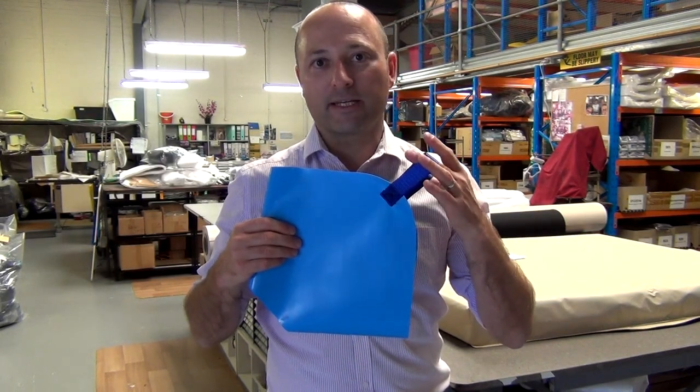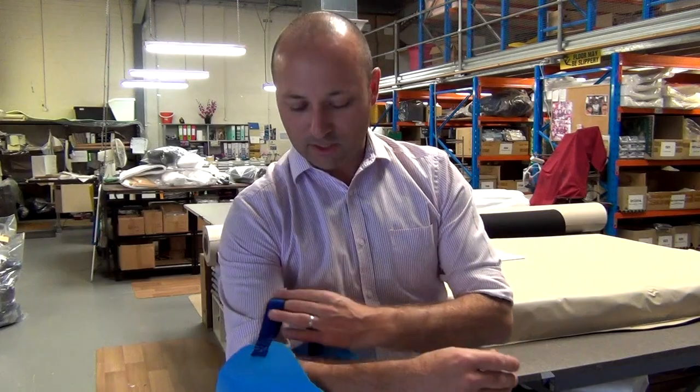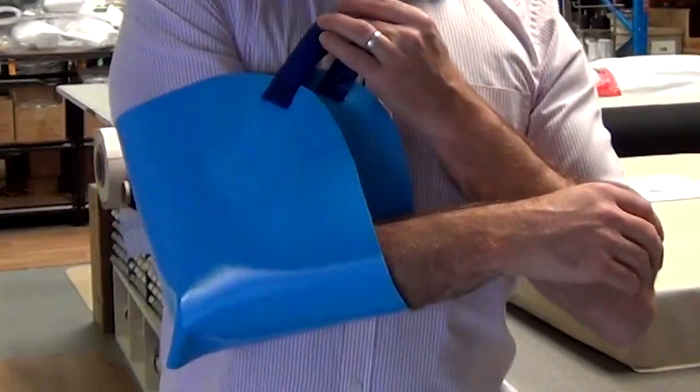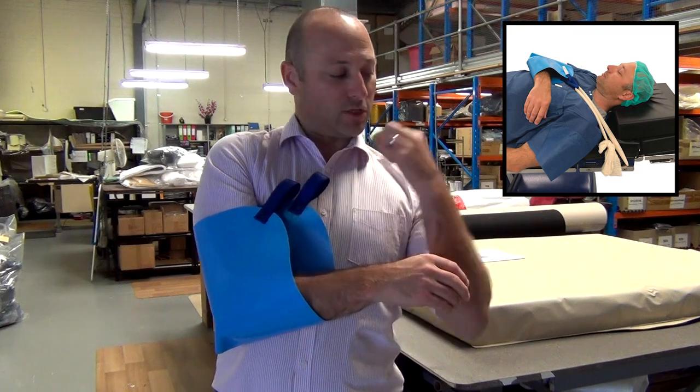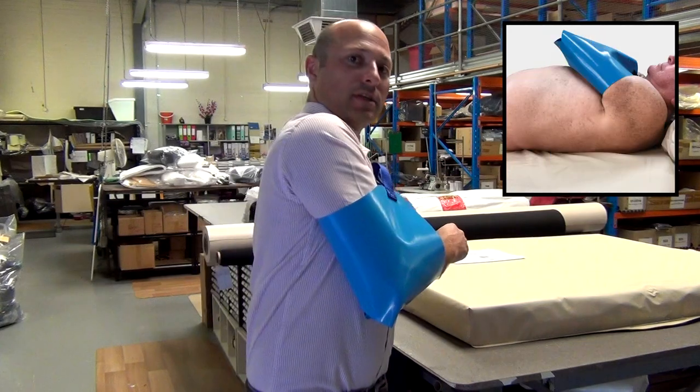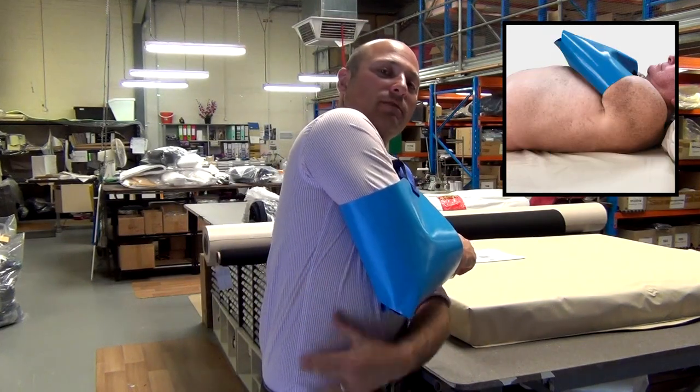I've got here the elbow sling for theatre. It's a new product recently developed. It's worn by the patient during an operation. Imagine I was lying down and there's a bandage that goes from the bed to the straps here to hold my arm out of the way so that the surgeon can access the side part of the body.